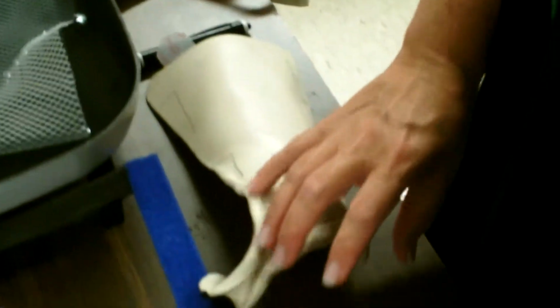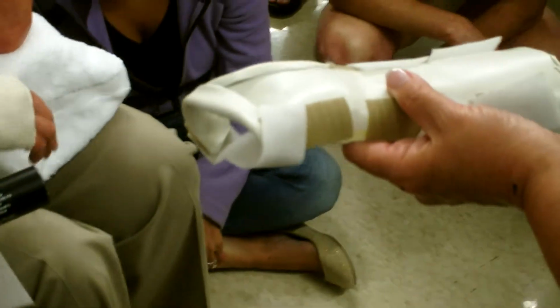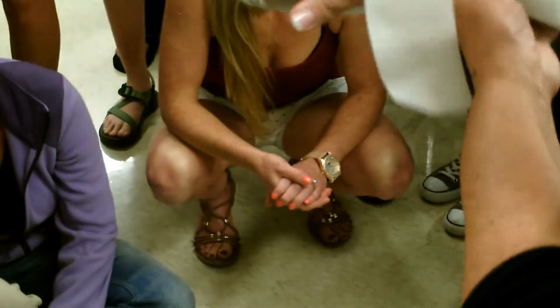Now, I want to show you something on the finished version. Right here is a finished version. Notice we rolled this back so that the thumb is free to still oppose and do what it needs to do. All we're doing is positioning the wrist. I'm going to turn this off, they're cold. This one's probably a little too extended for carpal tunnel. We want about 10 to 15 degrees. Now, this wasn't made on me.